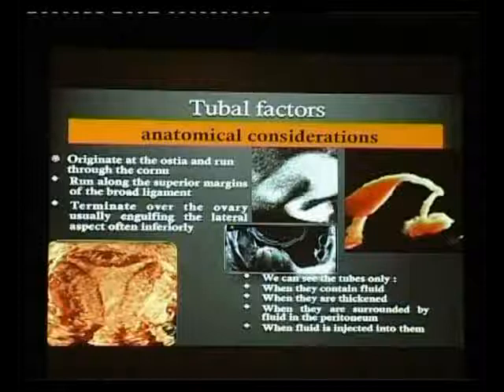This is one of the cases of a septate uterus, and in cases of septate uterus, we must measure the length of the residual cavity. We must measure the length of the septa, the vascularity of the septa, so that we can tell the clinicians if they need any surgery or any procedure. We must identify the bicornuate uterus from the septate ones, and uterus didelphys. Of course, this is one of my patients who's got absolutely normal marital history, and she's got 2 wonderful children, and she's had no problems as far as her fertility was concerned.